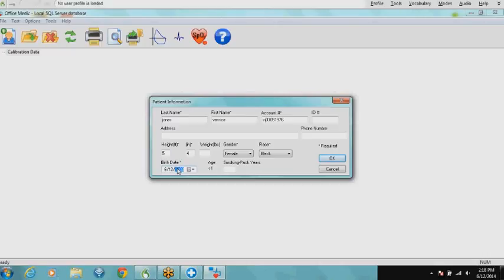You're in a year. You need to go to the month first. Let's go ahead and click into the month, 03, and then click into the next cell. Yep, that would be 05. Click into the next field and type in 1976. All right.